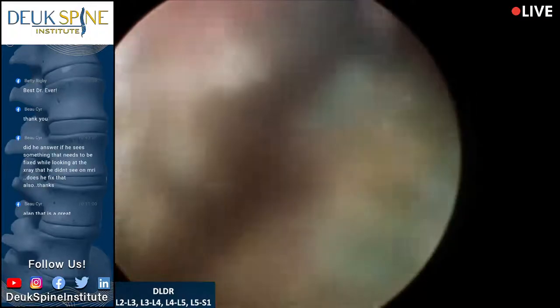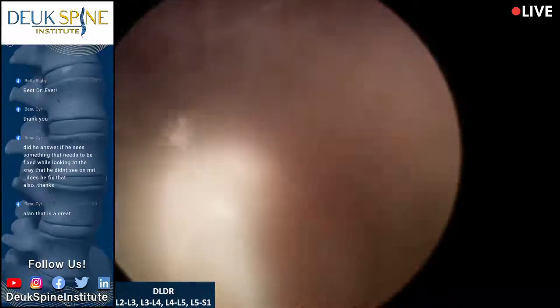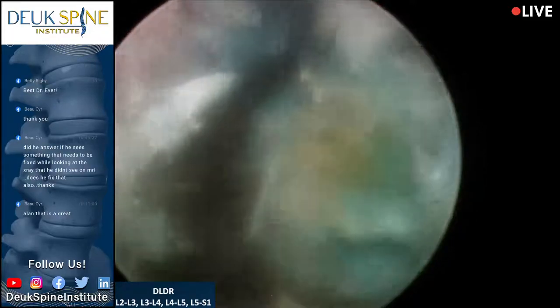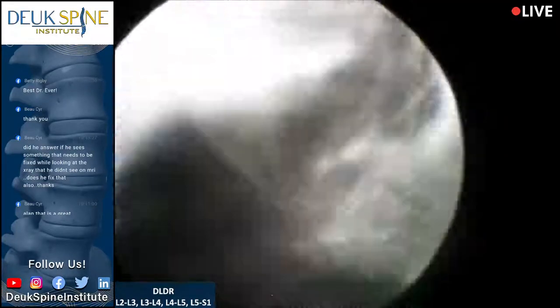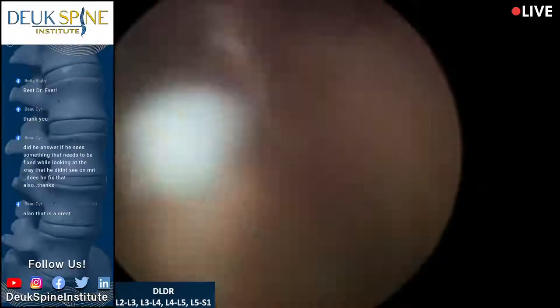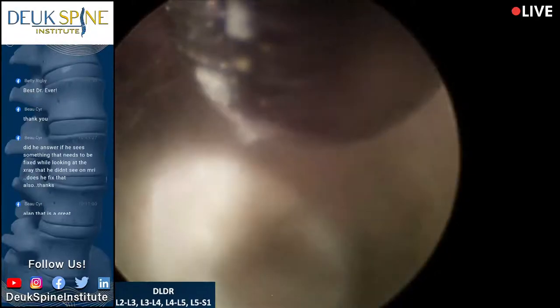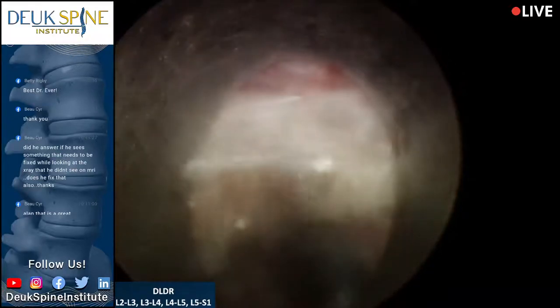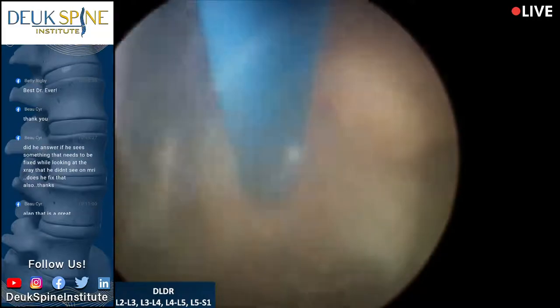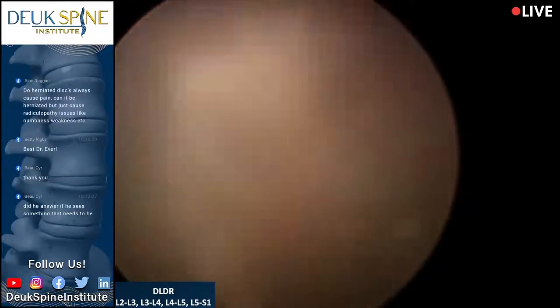If you were watching earlier, you saw that I did what's called a discogram. A discogram is when I test these discs to see if they're causing the patient's symptoms. And yes, indeed, they were. Hey, I think we got an irrigation issue. Yeah, he felt that. I think he just said, whoa, that's the spot. Look at all the herniations I've taken out on this one disc, incredible. This is a real deep tissue massage. You can see we're just about done with this tear right here. You can see a little bit of the fat from the epidural space poking its head out.